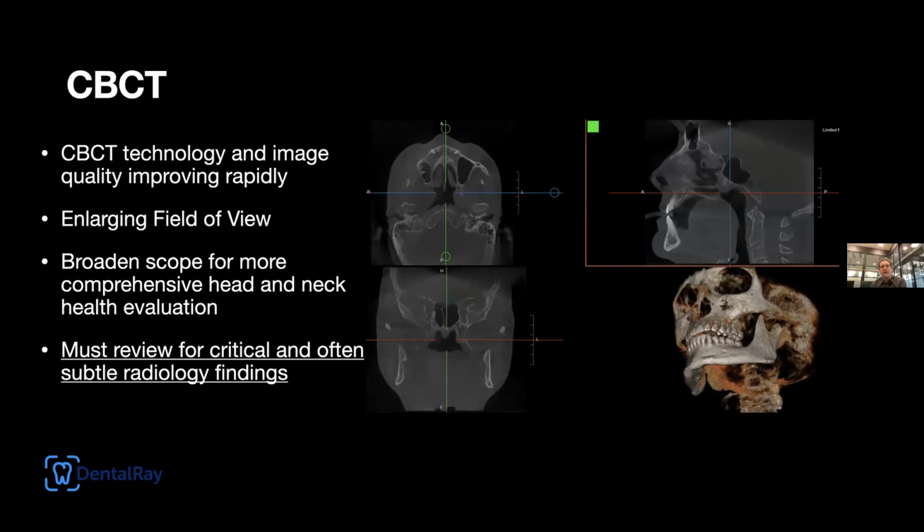It's been extremely impressive to see, as Garry and Eliot pointed out, the advances in cone beam CT. The quality that providers are getting at the point of care is really pretty astounding to me. And we all know that this field is moving quickly. The field of view that you're obtaining whenever someone does press the button is increasing generally as scanners become more sophisticated, and the types of pathology within the field of view are becoming more complex.